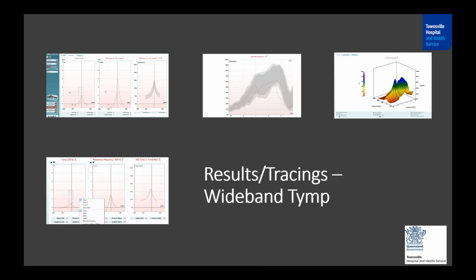In addition, Madhuri, you might have observed that even with a blocked grommet, sometimes we get an A-type tympanogram. We do video otoscopy, and the grommet is blocked. Sometimes, yes, an A-type tympanogram indicates it's just a grommet block and the middle ear is normal. If in absorbance you get a normal absorbance pattern in the presence of a blocked grommet, then you can assume that the middle ear transmission is good.